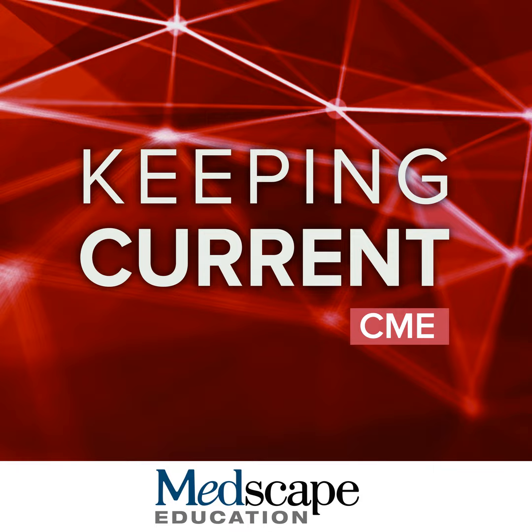Well, when you see the brain MRI, make sure the pattern looks like very early Alzheimer's disease, which should basically be a normal scan. We don't expect atrophy in the early stages. But if they've had a lot of infarcts or other pathology, that might actually explain the dementia, and they may not be a great candidate for therapy.